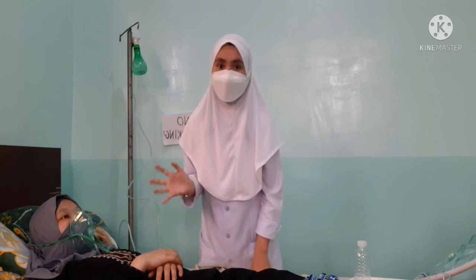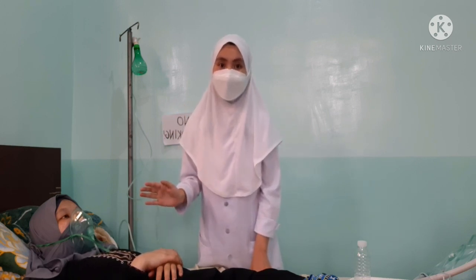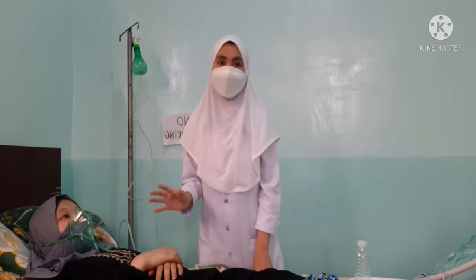The oxygen flow must be at the level to prevent the bag from fully collapsing during the patient's inspiratory efforts. The reservoir bag must not totally deflate during inspiration to avoid carbon dioxide build-up.